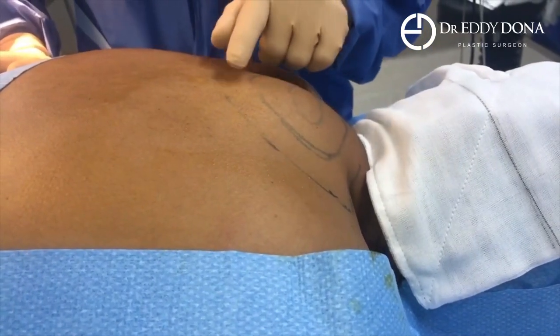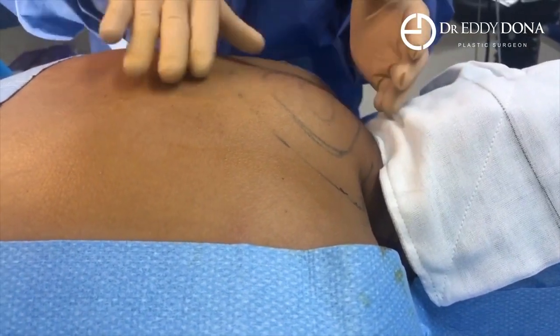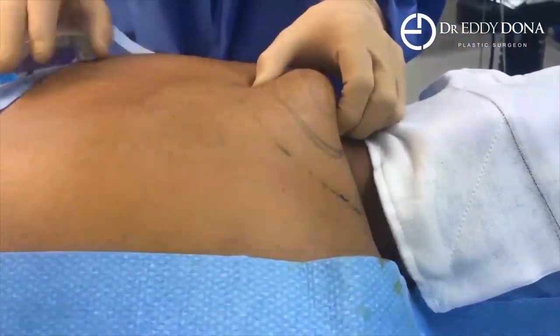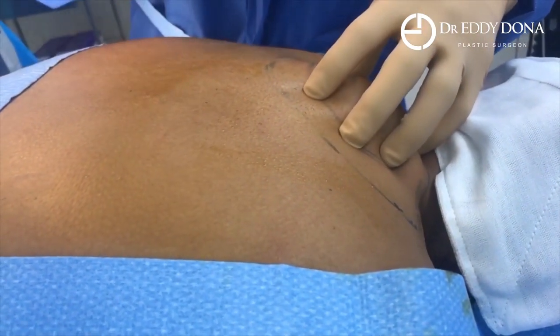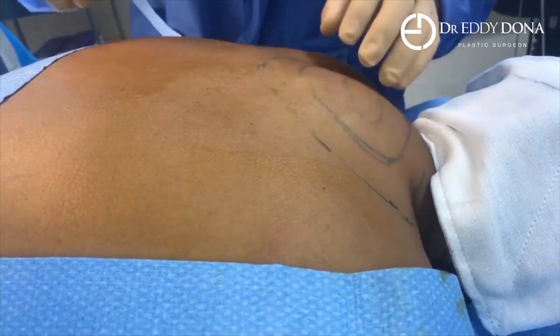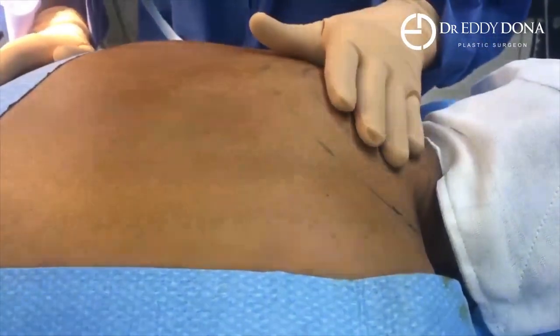To clarify, this is mostly fat — obviously there is the curvature to the spine — but that abnormal fatty deposition is confirmed. The fat here is typically very tough and very fibrous, so it's going to be a little bit difficult to come out. We're going to work hard to make it as thin as possible.